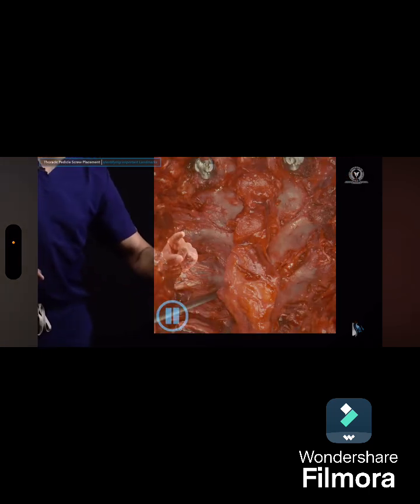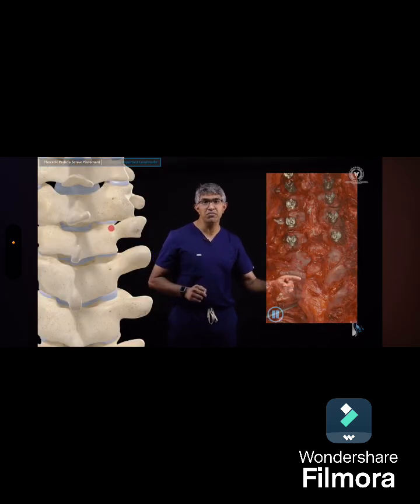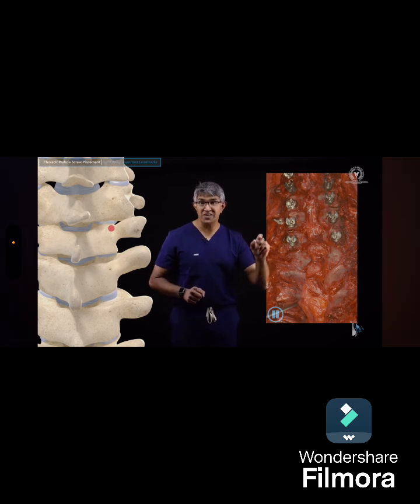That's kind of that ridge that meets you from the top of the transverse process down there. Here's the ridge that you see over here. From a craniocaudal perspective, I generally make my start point right on the ridge. From a medial to lateral perspective, you can get a sense of where the midpoint of the joint is, where the pars is, you extrapolate it up, and this kind of 5 to 6 millimeter range that's available to you for a thoracic pedicle screw start point.